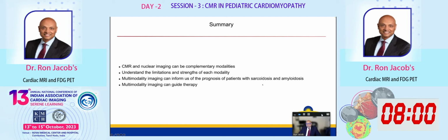A couple of other tips. Sometimes the right ventricle lights up on PET, and you have to go back and look at your CMR. LGE in the right ventricle is sometimes very hard to pick up and detect. The basal inferolateral wall LGE, again, when you have that soft finding, it's much more apparent on PET sometimes. So you go back and look to see is there some subtle LGE there. So you can leverage the two modalities and kind of train your eye that way.